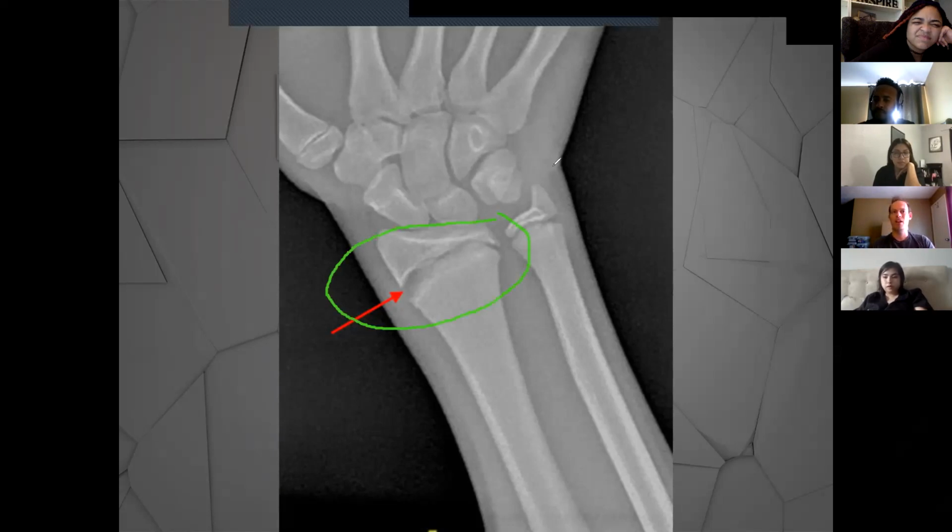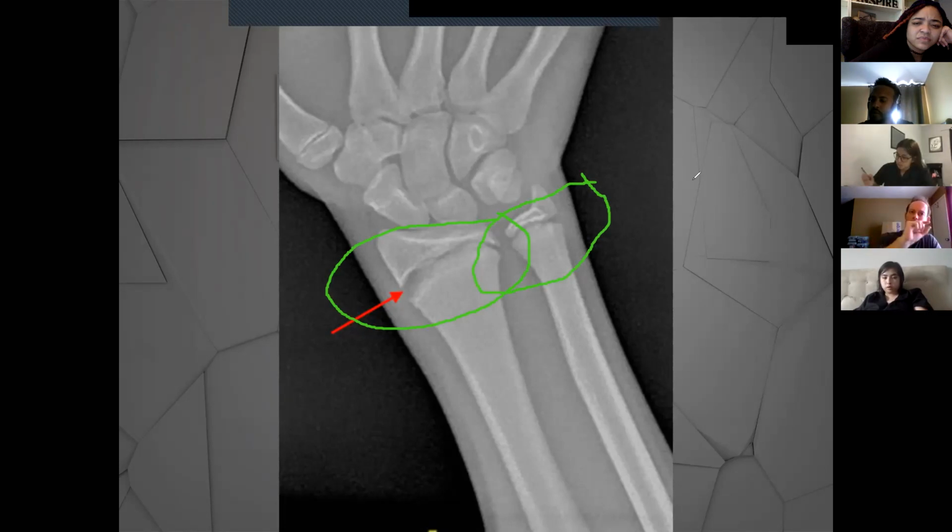Those growth plates will always be present on the distal and proximal ends of those long bones on children, and often will last all the way until they're close to preteen age, where they'll start to fuse together. I'll show you what that looks like as it fuses. It becomes a very distinct little line across the bone that looks like it's completely fused together. But don't get excited when you see this. This is not a fracture. This is normal. We all had these when we were children. These are those growth plates, or epiphyseal plates, on the distal and proximal ends of those long bones.